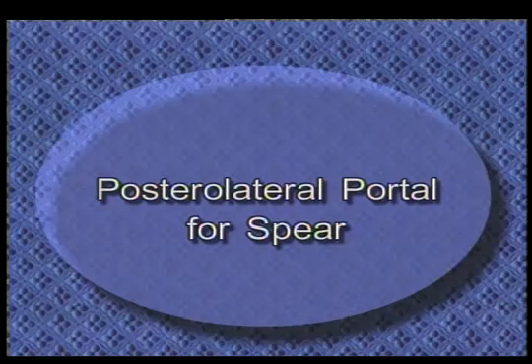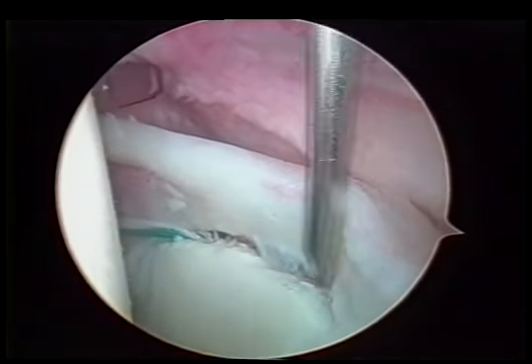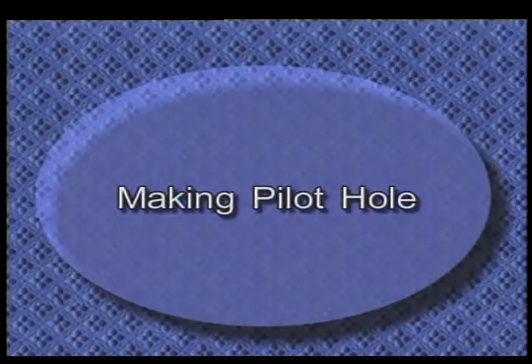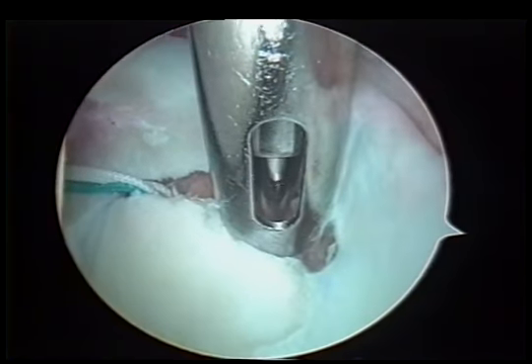Now we use a posterolateral portal to place our second anchor. Because of the posterior slope of the glenoid, we get a better angle into the bone by using this particular portal. You'll see that we use the trocar tip for introduction of our spear guide right alongside the needle, and we'll make a pilot hole just as we did for the anterior anchor. You see the angle of approach is just perfect for this anchor.